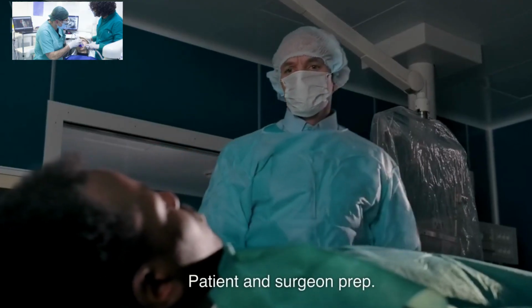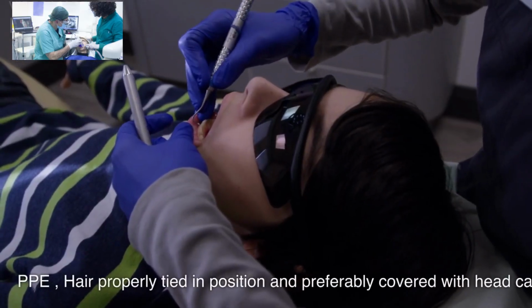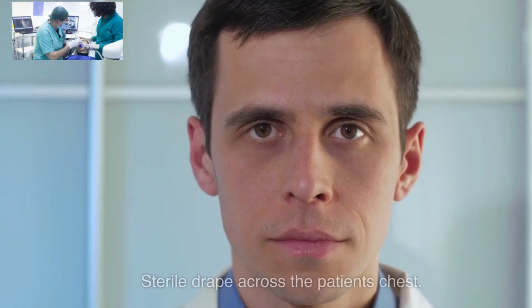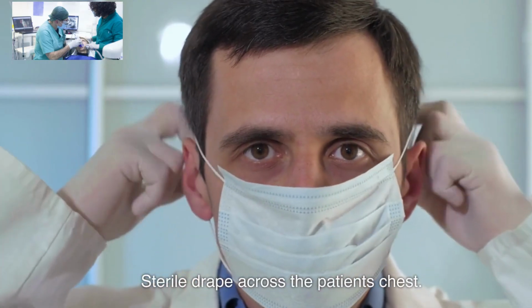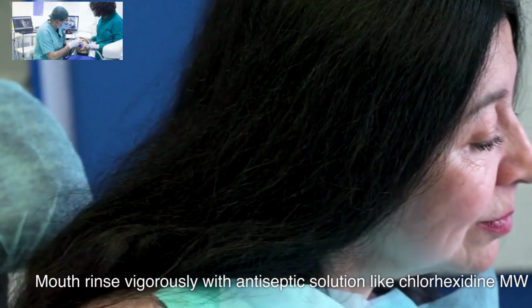Patient and surgeon prep. Surgeon: PPE, hair properly tied in position and preferably covered with head cap. Patient: sterile drape across the patient's chest. Mouth rinse vigorously with antiseptic solution like chlorhexidine mouthwash.